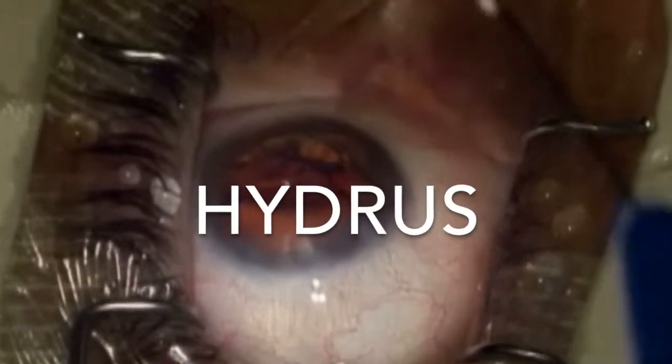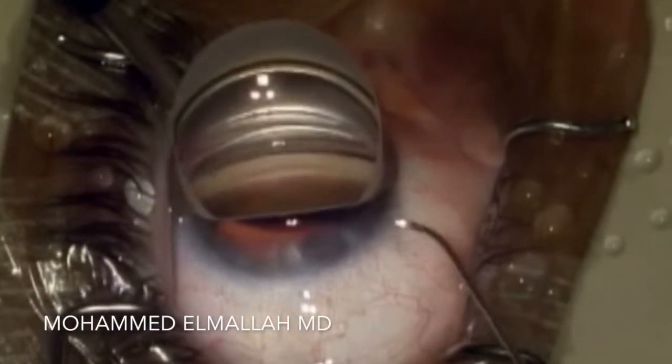Hi, this is Mohamed Elmala from Ocala, Florida. This is a case of a Hydrus microstent used in the management of primary open-angle glaucoma.